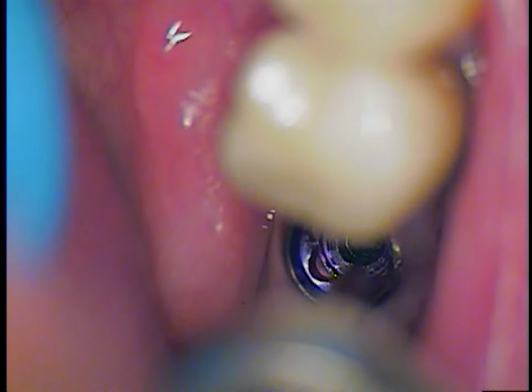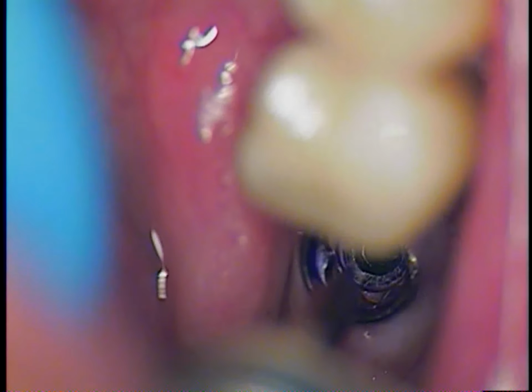And the patient realizes all of our attempts. He does have a background in machine technology. So let's see you on the next clip, okay? I'll try to shorten that one up a little bit just to show you the technique of the threader as we retap the threads for this case.